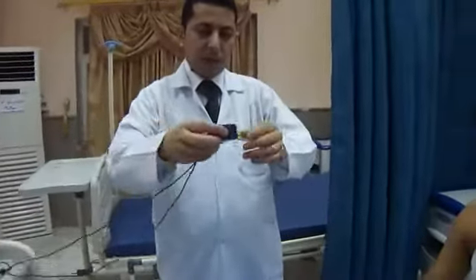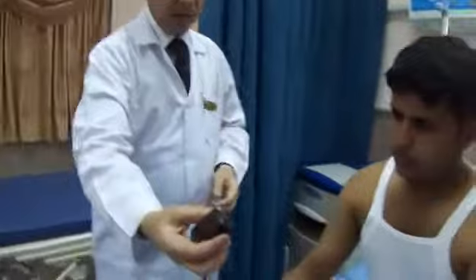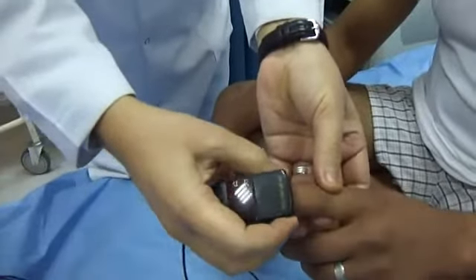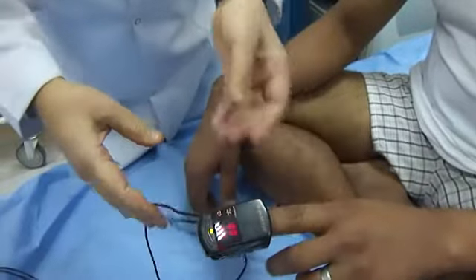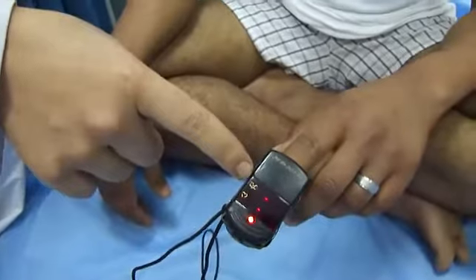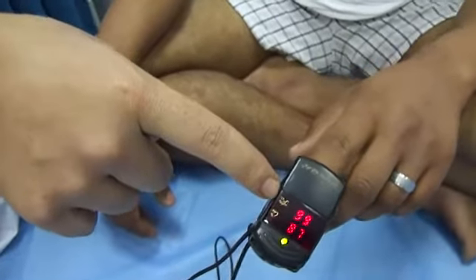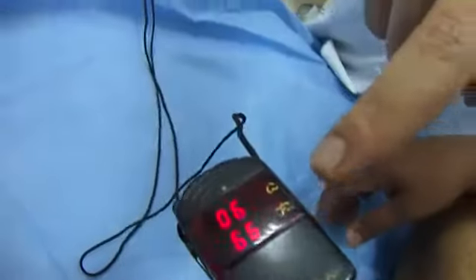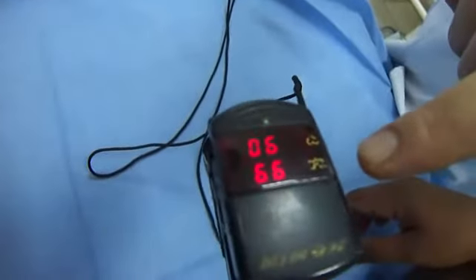Lastly, we have to check for the pulse oximetry using a pulse oximeter. This is the pulse oximeter, and I'll check the patient's left index. First of all, you have to choose 2 or more areas, and we will see here the saturation of the oxygen. Saturation of the oxygen of our volunteer is 99.